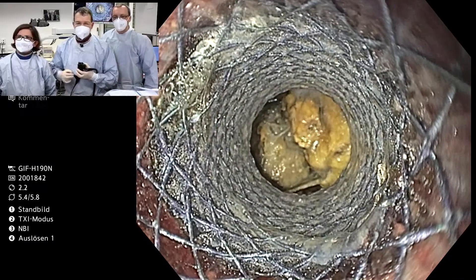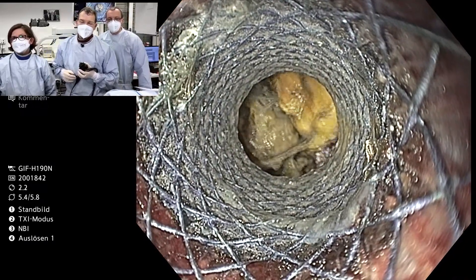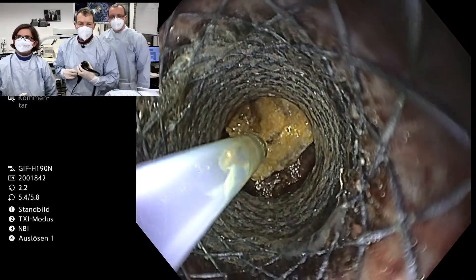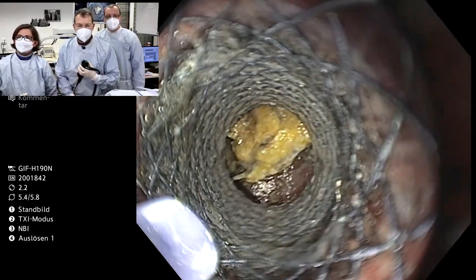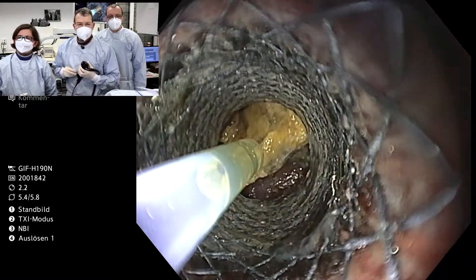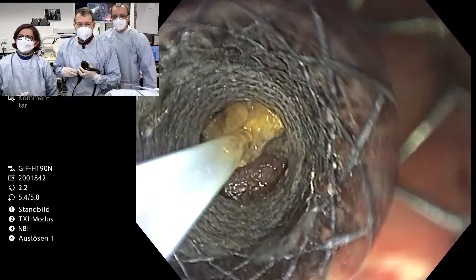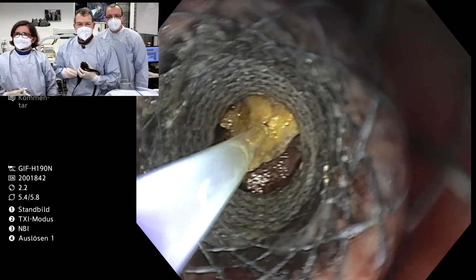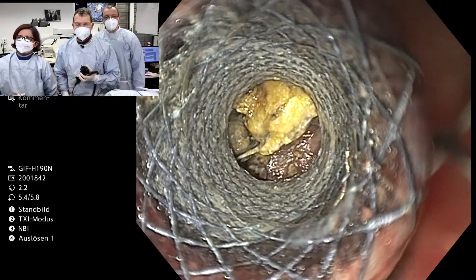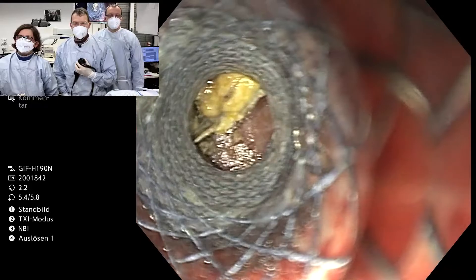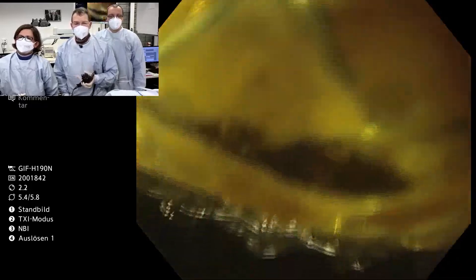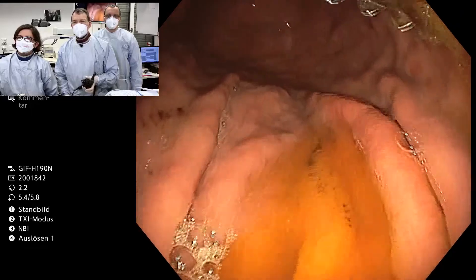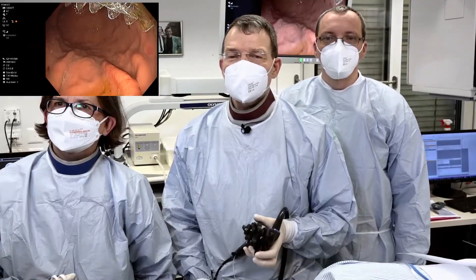You can see nicely the cavity with the necrotic material. The question is whether this necrotic material is already released from the wall — if so, we can take it out. I'm using a soft snare, but before trying to remove the necrotic material I will check if it's still stuck to the wall, and I think that is the case here. In this situation I would not perform an endoscopic necrosectomy immediately. I would wait a little bit — we have good access to the cavity and will check the inflammatory parameters over the next days and decide from there.